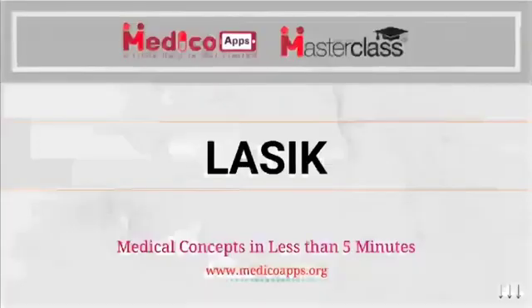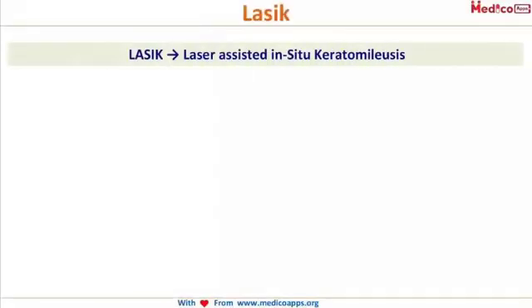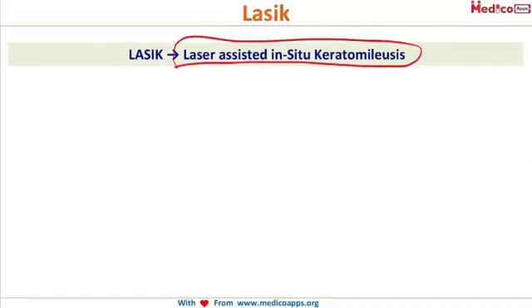So now the latest procedure is our LASIK. We all are familiar with this word. LASIK is laser assisted in situ keratomileusis. Kindly try to memorize this full form. Okay, it is laser assisted in situ keratomileusis. The word keratomileusis means change in the corneal shape. Change in shape of cornea.